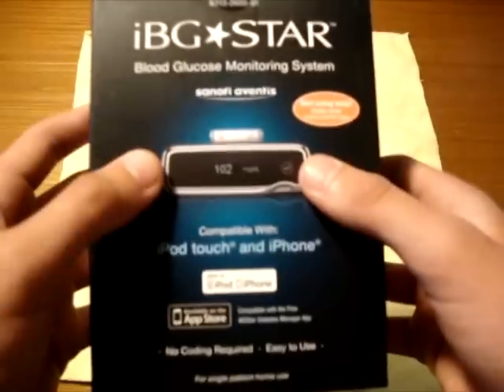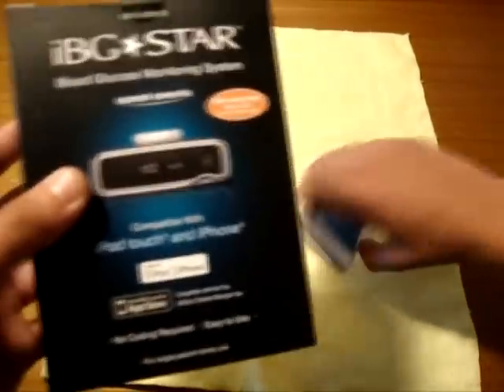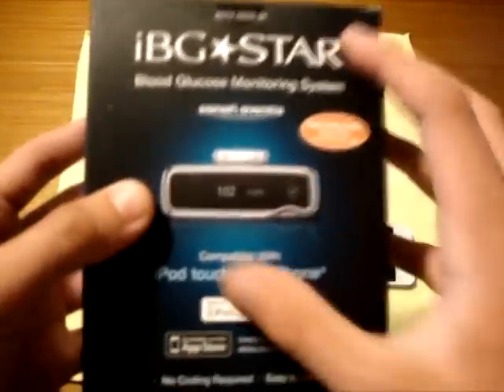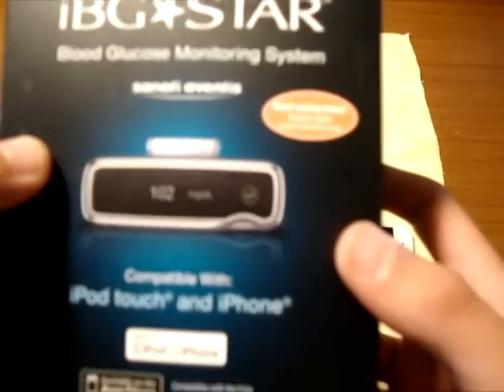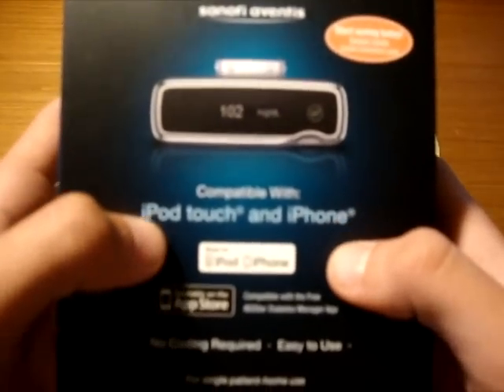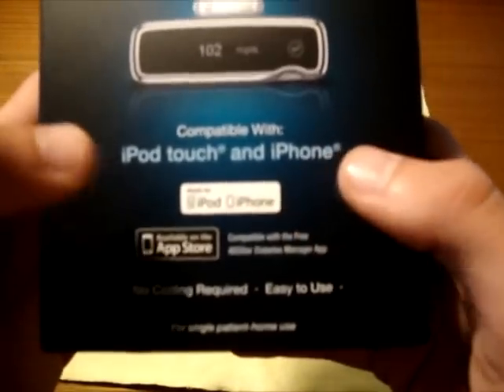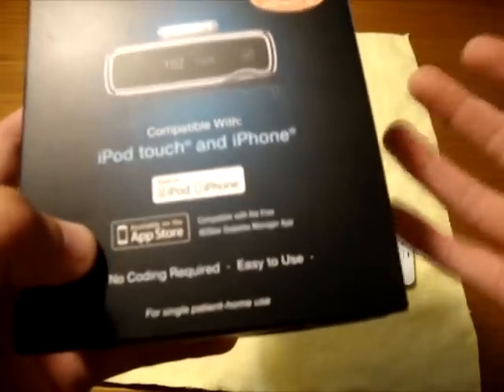On the front here you have the basic picture of the device. When I saw it in real life it was a super, super small device — it looks kind of big on the box, but in comparison to the 30-pin connector it's relatively small. They kind of blew it up for the picture. It says 'IBG Star Blood Glucose Monitoring System' and it's compatible with iPod Touch 2nd, 3rd, and 4th generations, and the iPhone 3GS, 4, and 4S.